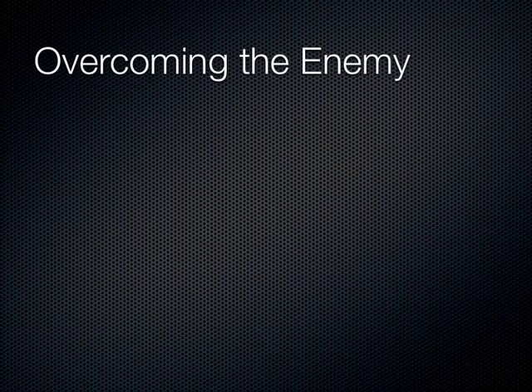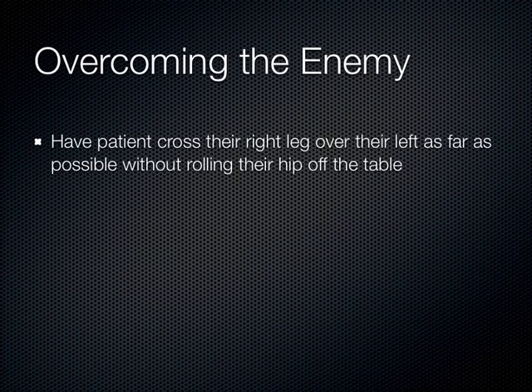So how do we overcome the enemy of bowel gas? Well, the first thing I do is I have the patient cross their right leg over their left leg, and we'll do this today with the models. On my earlier demonstration, I forgot to do that, but I think it's important to put the right leg over the left leg as far as possible without the patient falling off the table. And then you're going to push really hard.